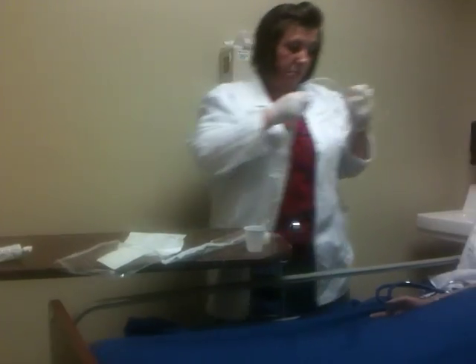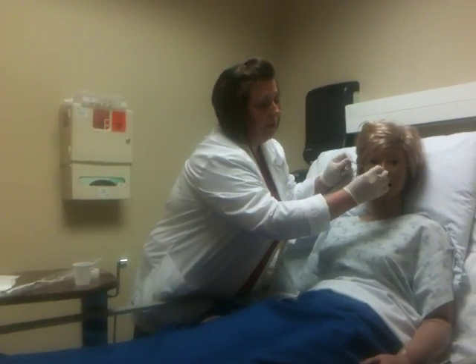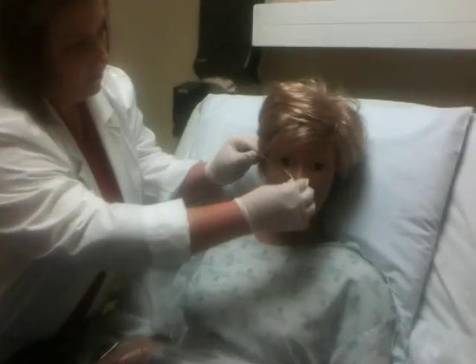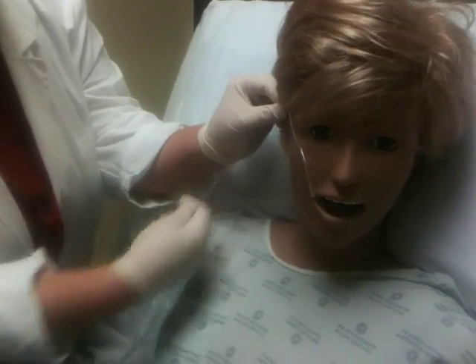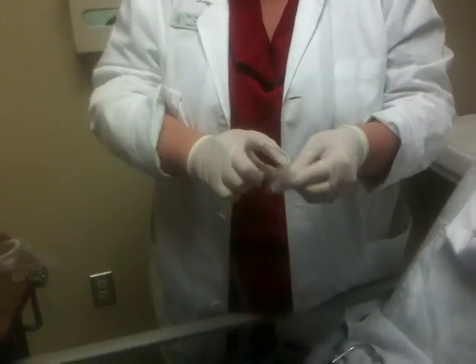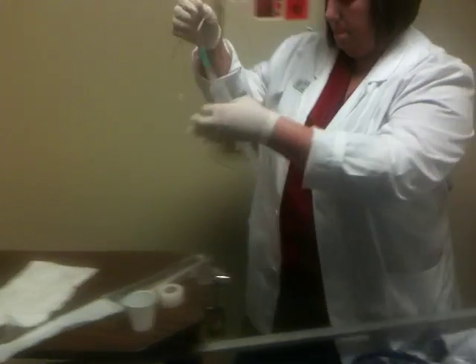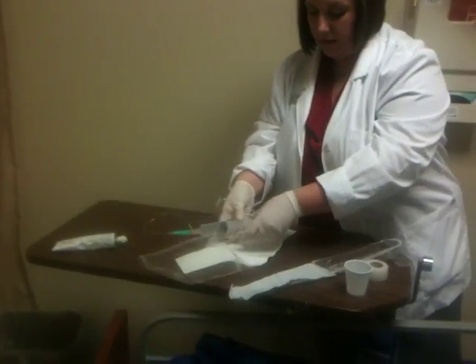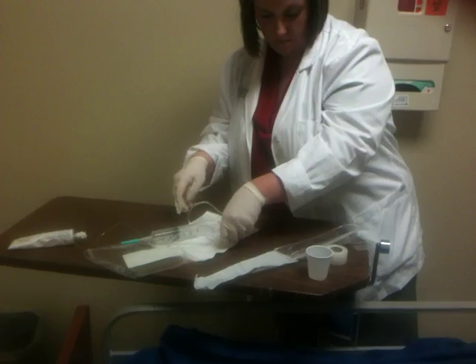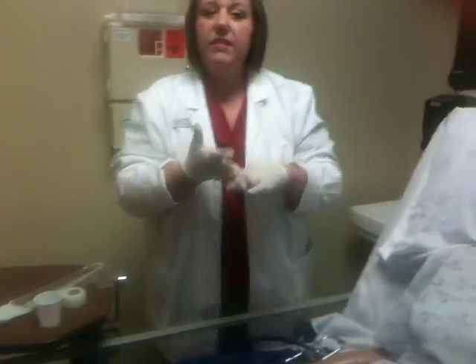At this point, I'm going to go ahead and measure my tube. I measure it from the tip of the nose to the ear down to the xiphoid process. Okay? And I put my piece of tape to mark it. Okay. And this is not a sterile procedure, so everything's clean.